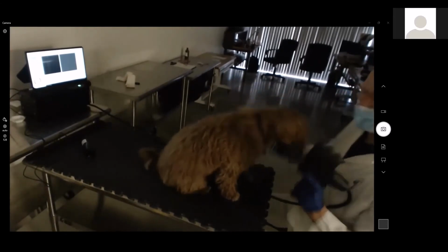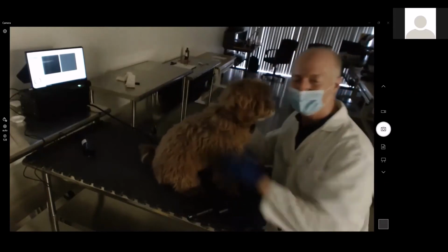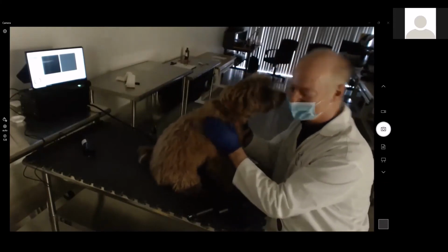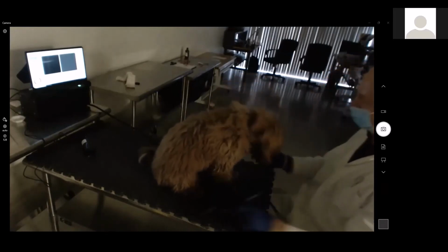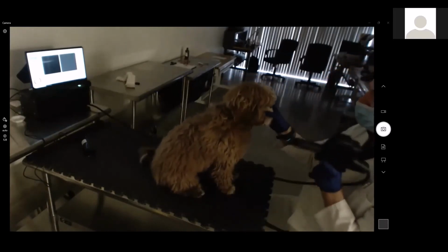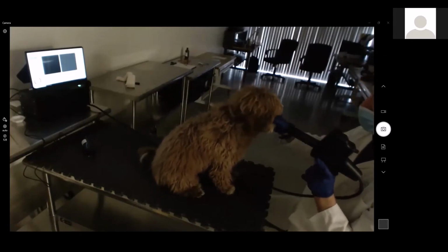Okay, this is Axon. He's my buddy, he's my baby. Okay, you're going to work for me, man? You can earn your kibbles. All right, so we're going to come in here and get the scan going. I've got a foot switch over here, by the way.